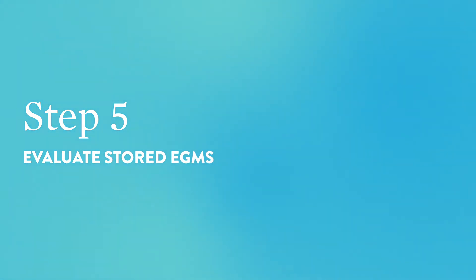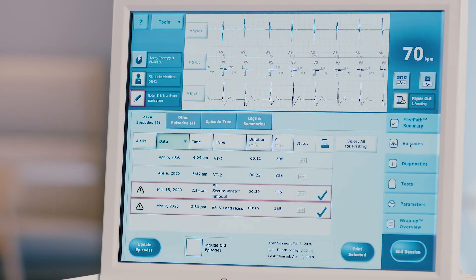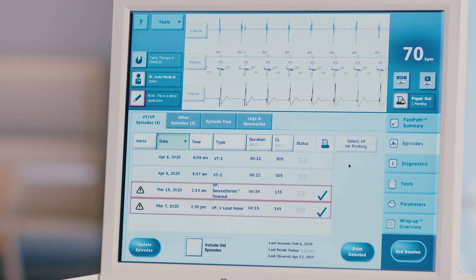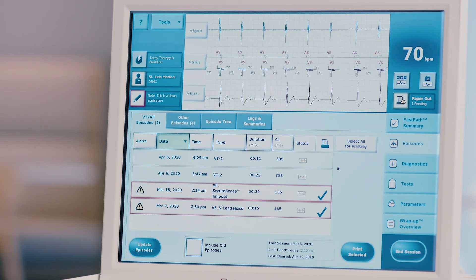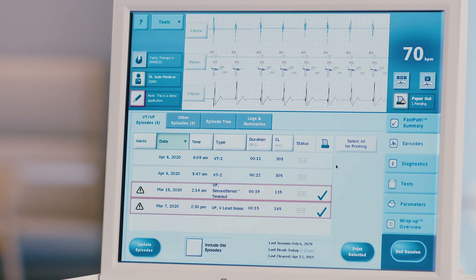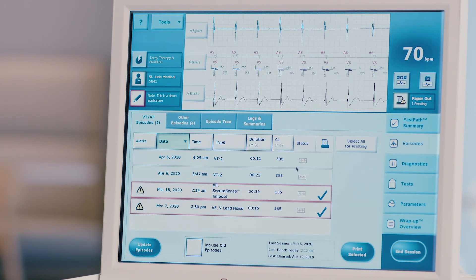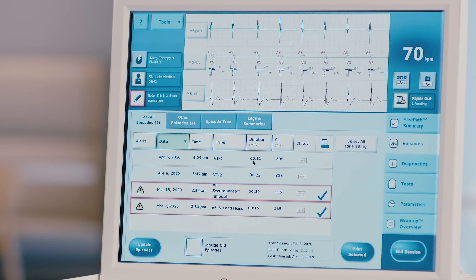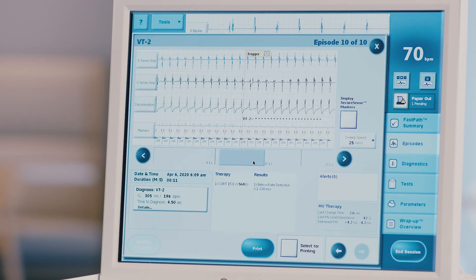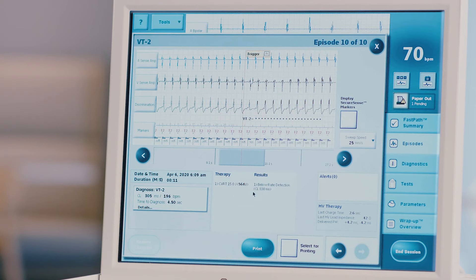Step 5: Evaluate stored EGMs. Press the episodes tab on the right-hand side of the screen to open a list of recorded episodes. The VT-VF episode screen will appear listing all VT, VF, SVT, and NSVT episodes recorded by the device since it was last cleared. Any episode that has an accompanying recorded EGM will be noted by this icon. Choose the episode to be evaluated by clicking on it in the list. The stored EGM will open on the screen and include all relevant episode data: date, time, duration, device diagnosis of the rhythm, time to diagnosis, cycle length, therapy received, results of therapy, charge time, high voltage lead impedance, and delivered pulse width.